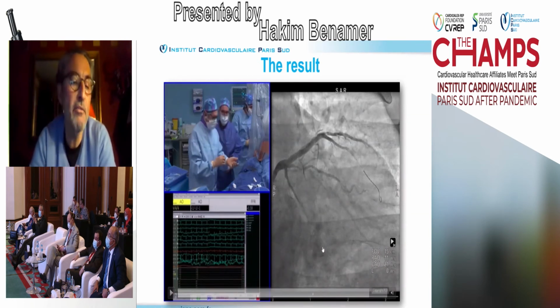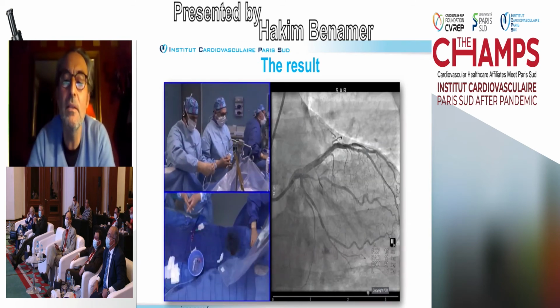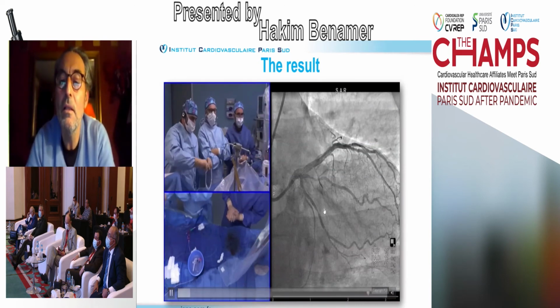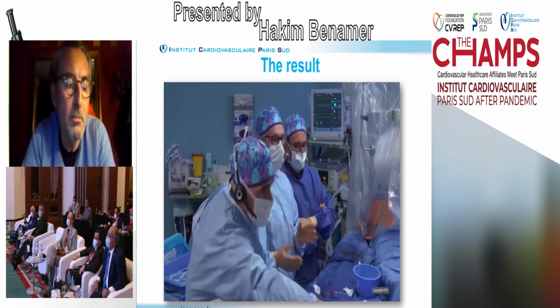Sorry, I have summarized the case a little bit, but we did, of course, the kissing with the circumflex. We did the kissing with the diagonal branch, and the result was quite good. So you will see, we have 6 minutes left of the transmission. It looks like we've been making some excellent progress. So let me show you only the result.